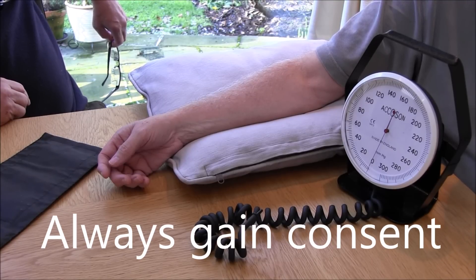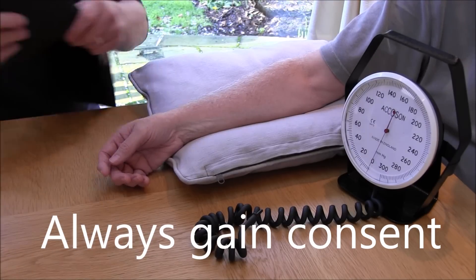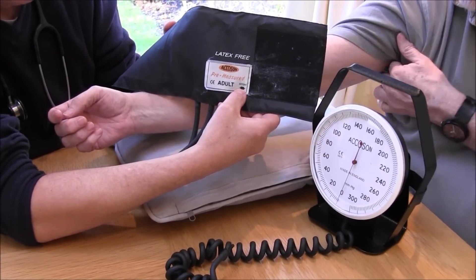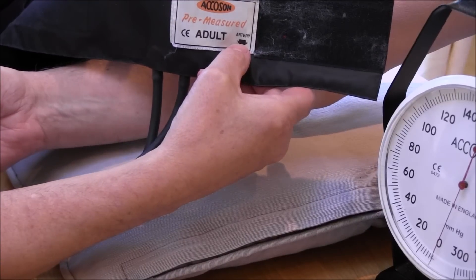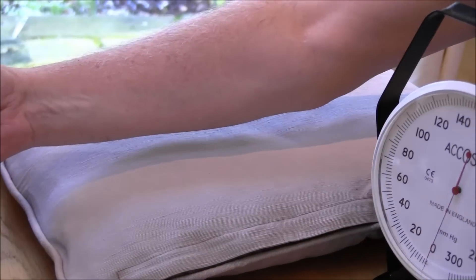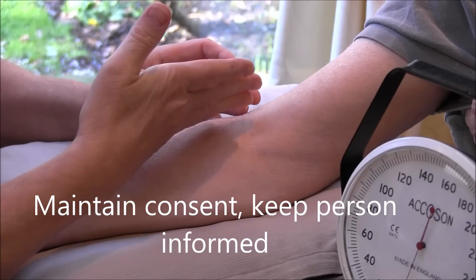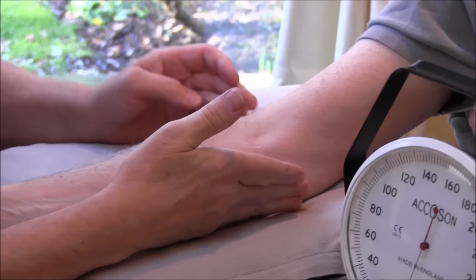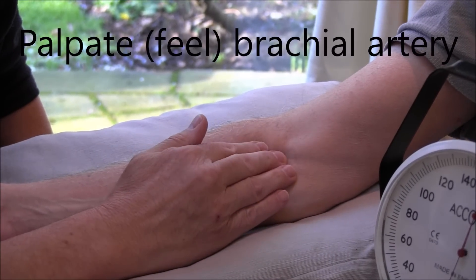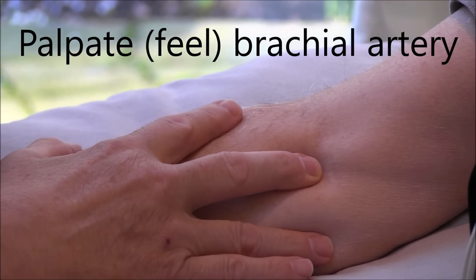Bill, we've been keeping an eye on your blood pressure lately — I'd like to check it now. So I'm going to put this cuff onto Bill's arm. We can see there's a line there that says 'artery' — that's going to go over Bill's brachial artery. I'm just going to palpate Bill's brachial artery now. The brachial artery is medial — two thirds of the way across to the inside. This is the medial surface; this is the lateral surface. The brachial artery is just here.